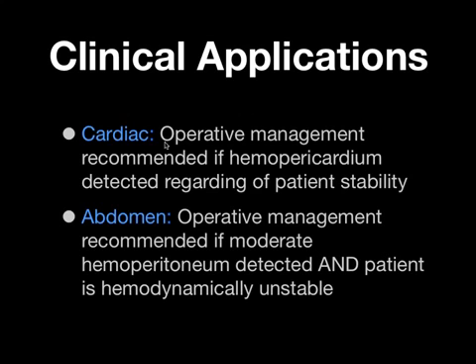Using ultrasound or the FAST exam to rule out intra-abdominal injury is going to get you into trouble and the patient into trouble. If you look at the study that was done in shock trauma years ago, they found that over a third of their patients who had splenic injuries and/or liver injuries had no hemoperitoneum on the initial CAT scan.